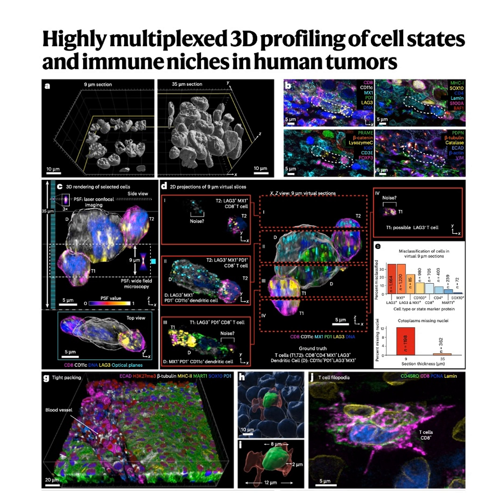And the fix, detailed in this paper, is 3D CyCIF. It uses much thicker tissue sections combined with optical sectioning via confocal microscopy. This preserves the vast majority of cells intact and allows computational reconstruction of the full 3D environment. Correct. It provides the necessary ground truth by capturing whole cells in their actual spatial context.